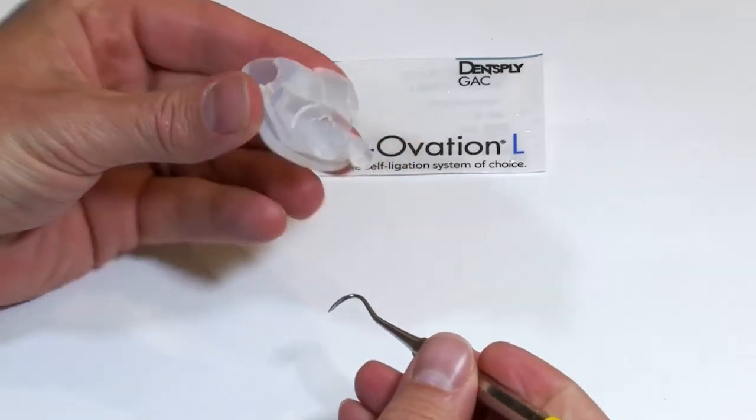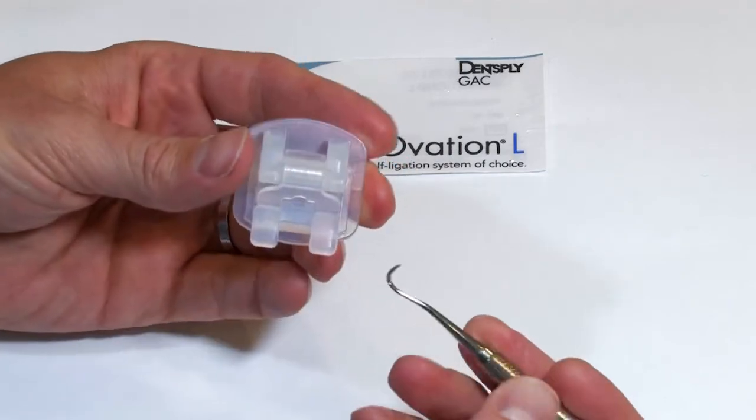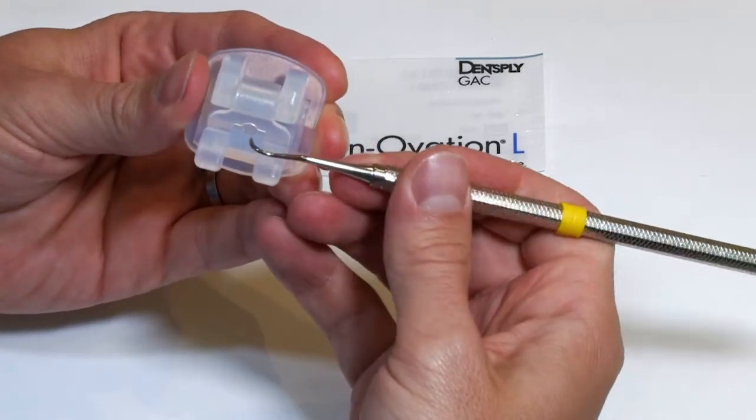This is just a blown up version of the Innovation L MTM bracket and I just want to be able to show you some of the features in a close-up manner.